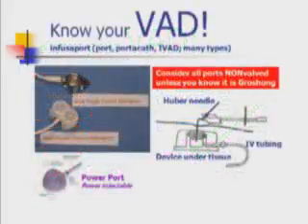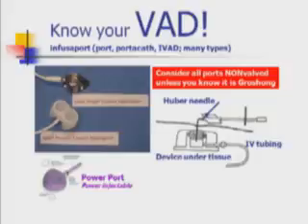An implantable vascular access device, often called an IVAD or port, may be surgically inserted. These devices are intended for patients who are receiving long-term therapies such as chemotherapy. They are placed completely under the skin in a subcutaneous pocket. They are accessed through the skin using a non-coring needle, for example, the Huber needle. The port is usually located in the chest.